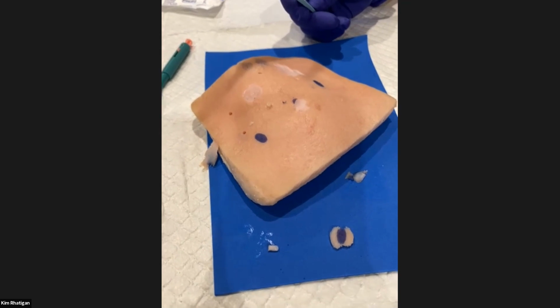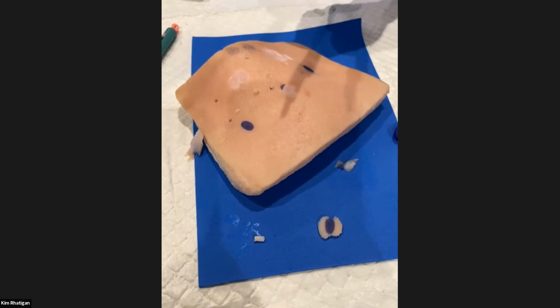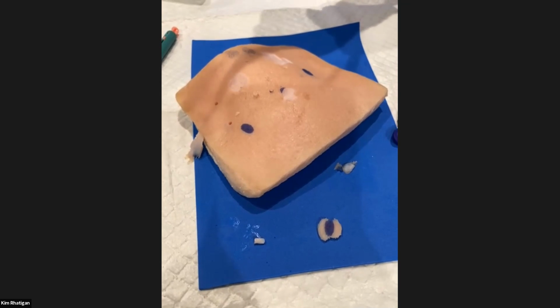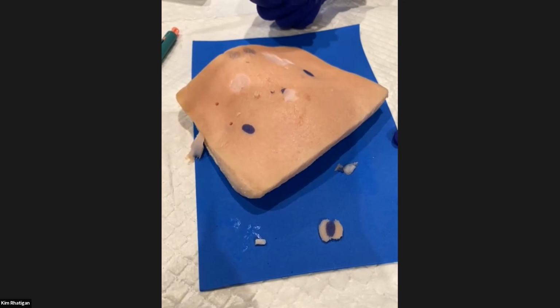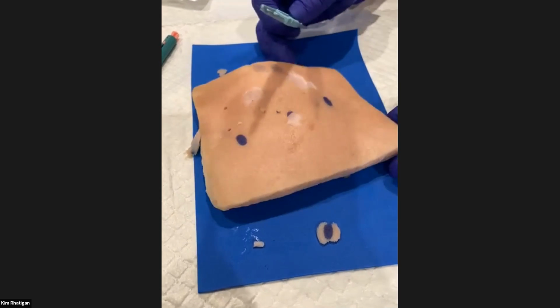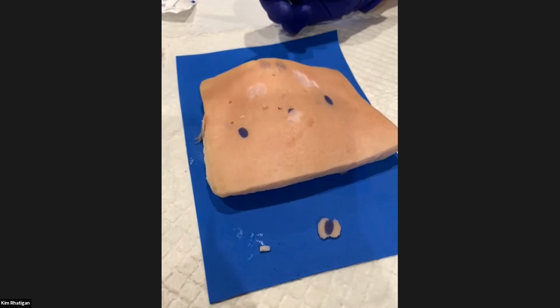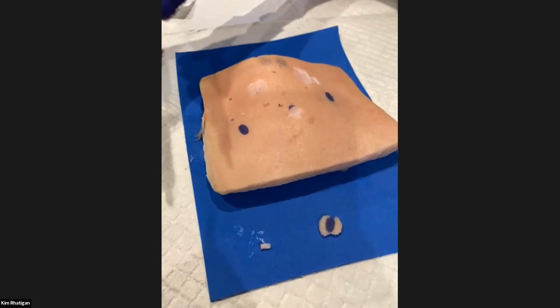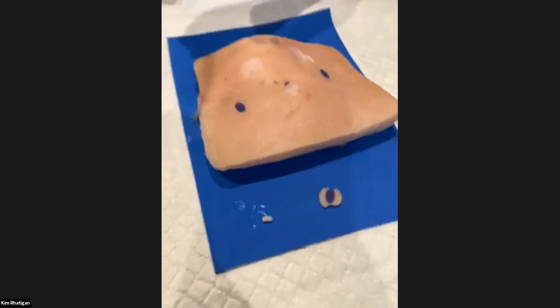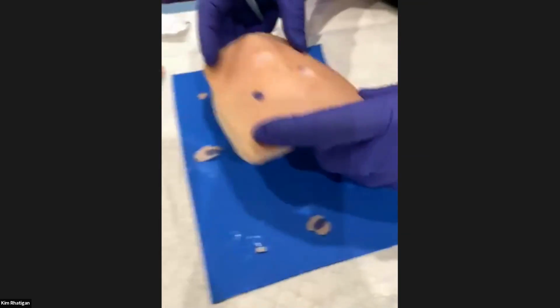Dr. McClain, sometimes people do 2 shaves. They do a very thin one, and then they do it again. So you could do multiple shaves on the same spot. I call that a shave and a reshave, but that's not medically correct. But if they feel they didn't go deep enough the first time, they could do a second one. All right, so let me do one more like this, the way he did it.